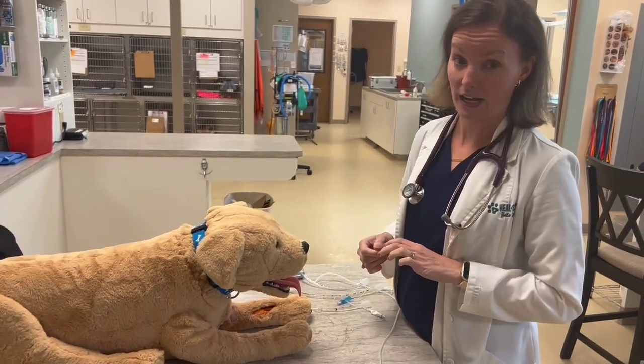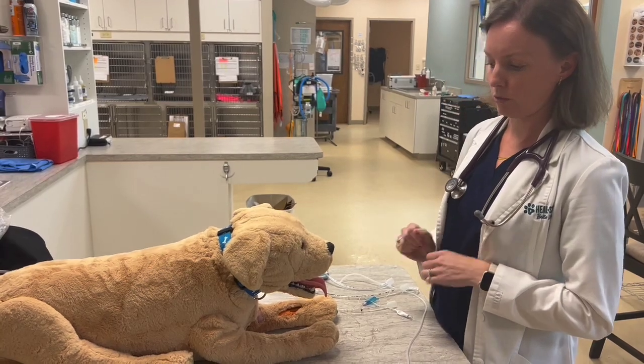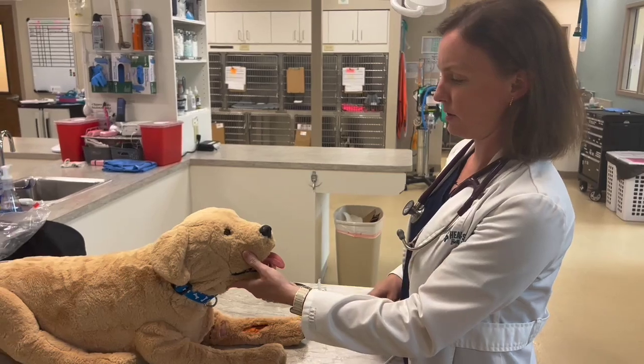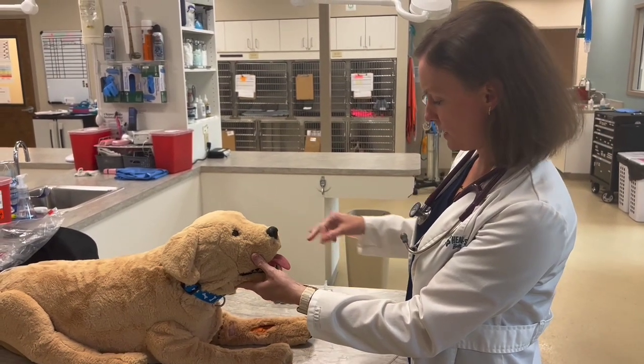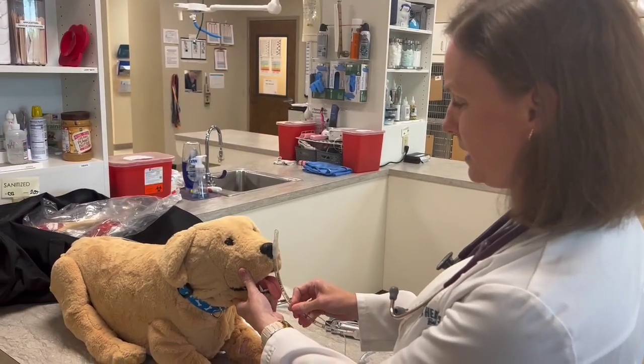This is to demonstrate how to intubate a dog. The first thing you want to do is make sure you have the appropriately sized tube. The way we typically do that is to measure from the nose — on this dog, probably more like a five and a half would be good.